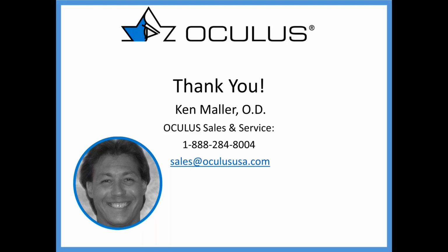Now, as far as what do you do about that? Well, I don't know. You wash them out. So are you putting them back into Ortho-K? You're going to give them some glasses. You're putting them into some rigid lenses with toricity. You would obviously just address it optically. Now, if you're telling me that you have a cylinder on the cornea and you're putting them back into Ortho-K, I would say now you need to address whatever cylinder is there so you can optically give them a result that they can see properly through. So I think I answered all the possible alternatives to that particular question.